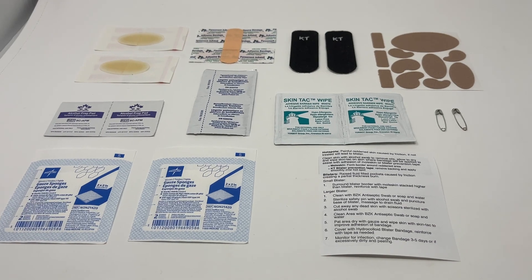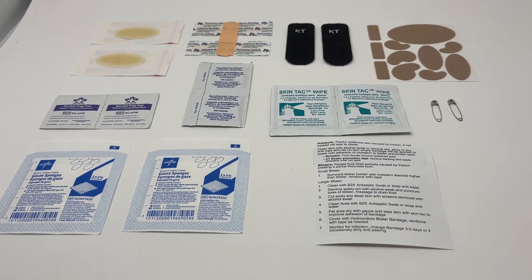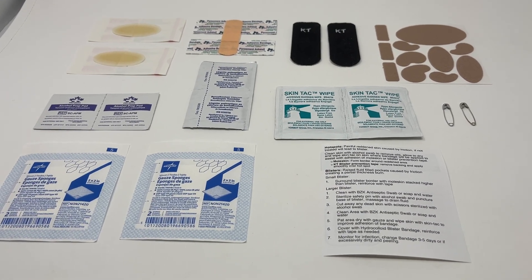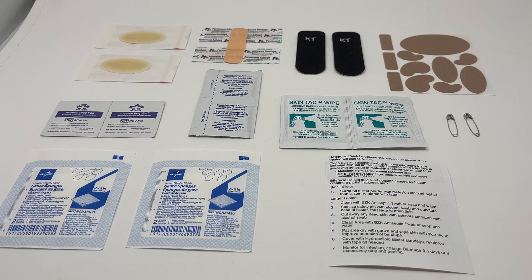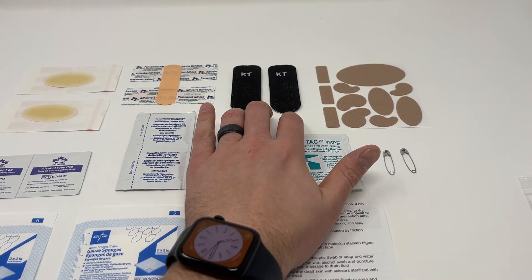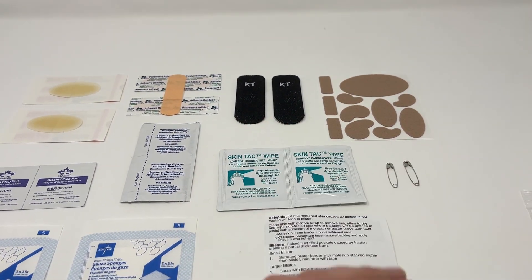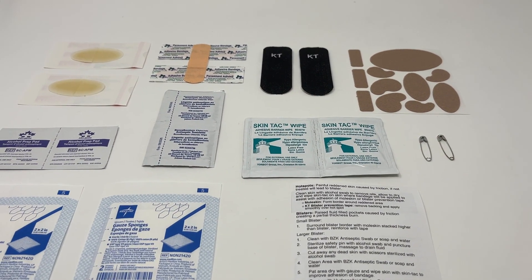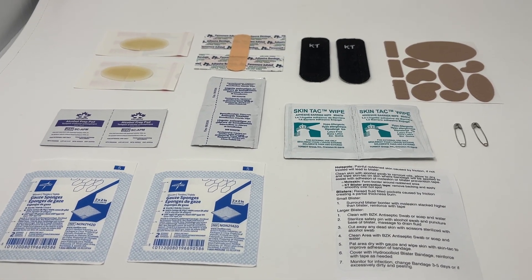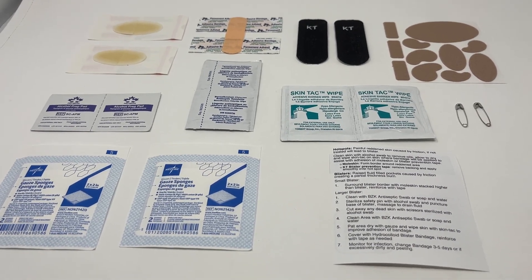What we really pride ourselves on at WildMed Kits is not only providing really good quality gear, but providing some education on how to actually use these products. For blister management, you can go from managing hotspots — where our KT prevention tape and moleskin really play in — kind of beating the blister before it becomes a blister. Then once you have the blister, there are a number of ways to manage it, and everyone's got their own style, so we wanted to fit everything in here to meet everybody's needs.